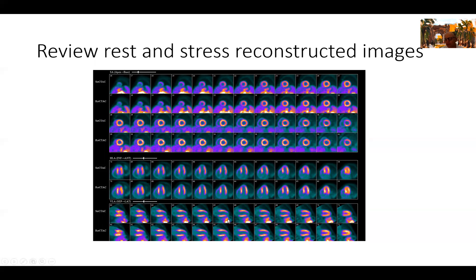In a normal situation, we would call this a scar, but we learned from other sessions and from our experience that you can never call this a scar. You can call it a fixed defect, and you can only ascertain if it's scar or hibernating myocardium by going on to do an FDG study. So from this, we know we have no ischemia, but we have a fixed defect in the distal LAD territory in the apex.